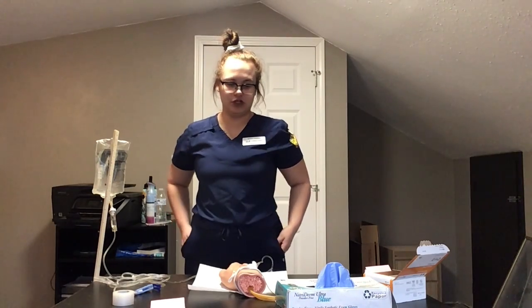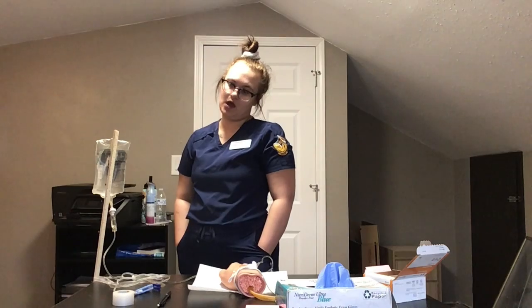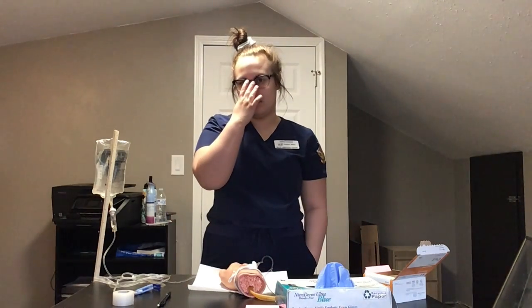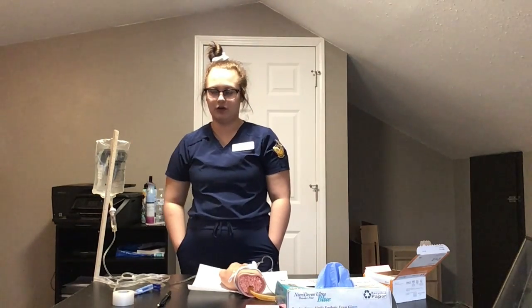Now that I have my IV in, I'm going to monitor the infusion. So first, I'm going to gather all of the important information, like the type of the IV solution that I use, the sequence, the flow rate, all that stuff. And then I'm going to make sure that all of that is correct, that it's the correct solution, it's being infused at the correct rate and time and all that.